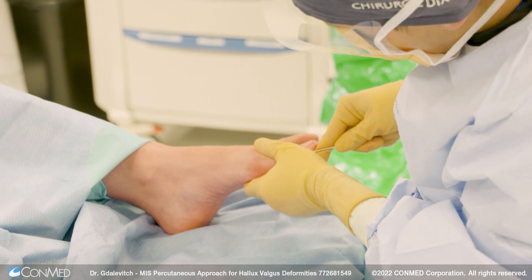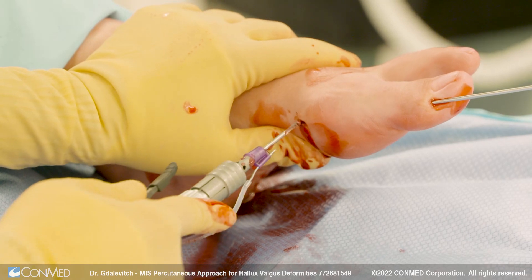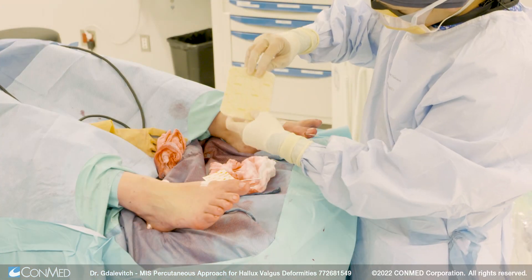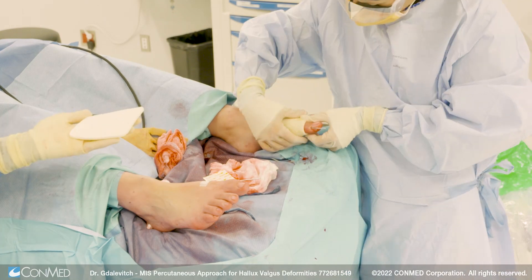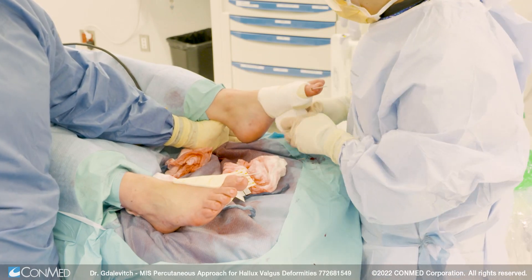When doing bilateral cases, it's important to have the C-arm operating from the same side of the surgery. The dressings are done at the end. We use a padded sticky dressing for the first metatarsal ray to help support it for weight bearing, and the dressing's purpose is also to help support the wire.